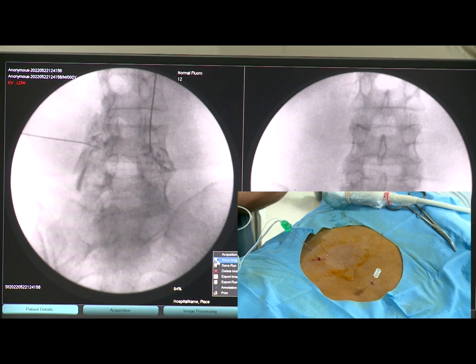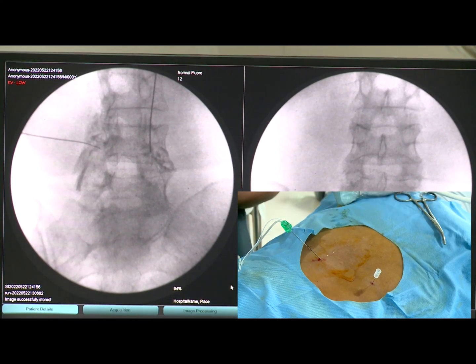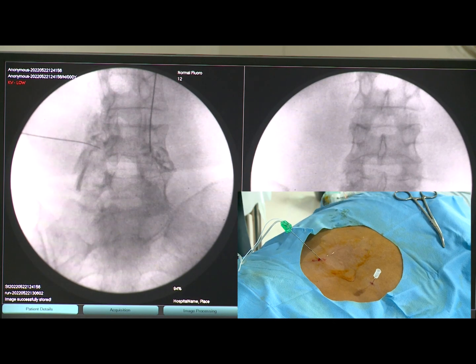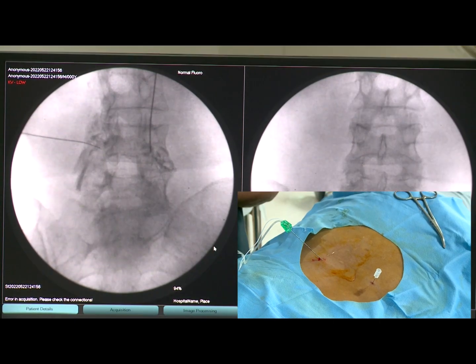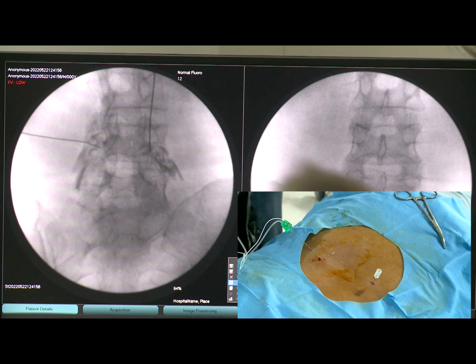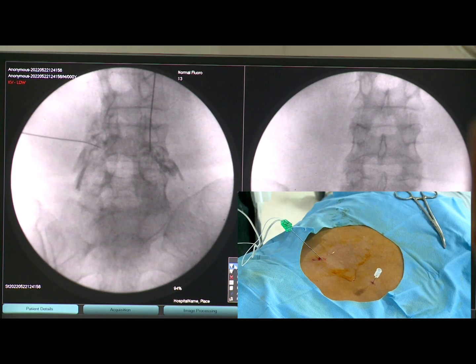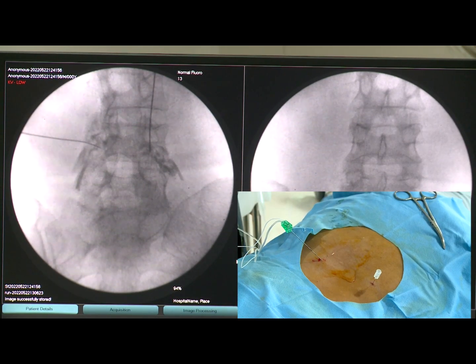The foraminal approach is now very nicely visualized. Both the exiting as well as the traversing nerve roots are nicely seen — both the traversing as well as the exiting nerve root is very nicely visualized.